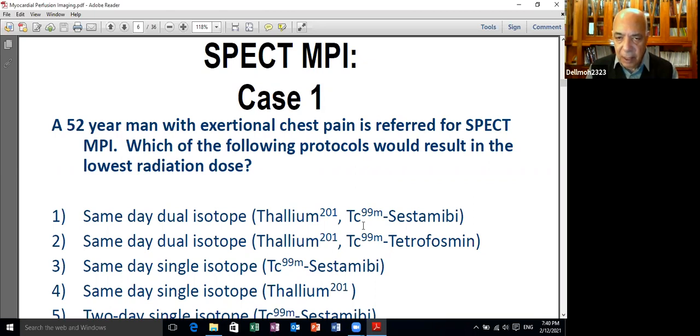The technetium is taken by the cardiomyocyte. It sticks to the inner mitochondrial membrane. And within 6 hours, which is the half-life of technetium, it gets fixed to the inner mitochondrial membrane, and it changes gradually into technetium in the stable form. So that's the meaning of M. We go back to the relative energy value of each of these 2 tracers. Thallium is by far much more energy producing, 3 times to 4 times that of technetium.